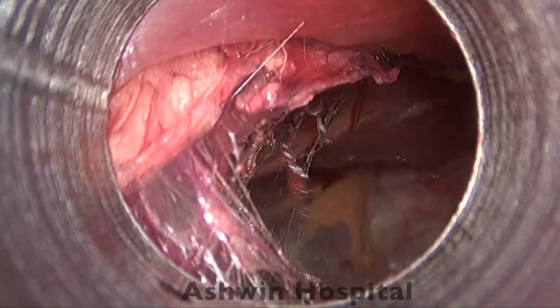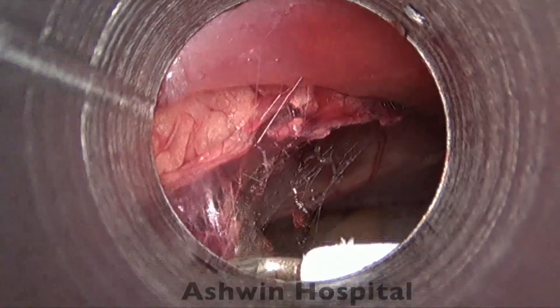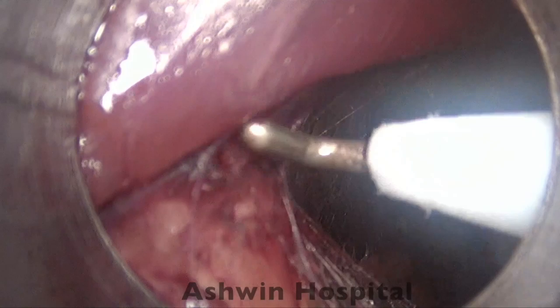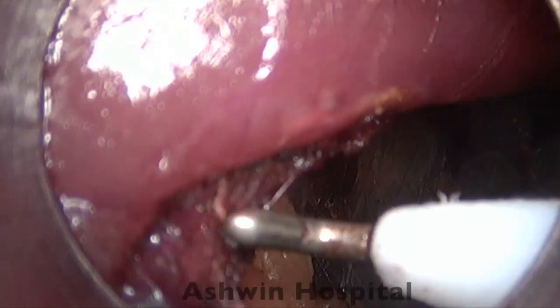towards the camera port. Now you can see we are working in the midline, which is close to the port. Generally, there'll be a lot of fogging in this area. And you can see we are staying quite close to the rectus muscle on the roof. We don't try to go too low, because sometimes the peritoneum might be very close, and if you're not careful, you can cause a small buttonhole in the peritoneum, and that can lead to the loss of planes and make it more difficult for you.